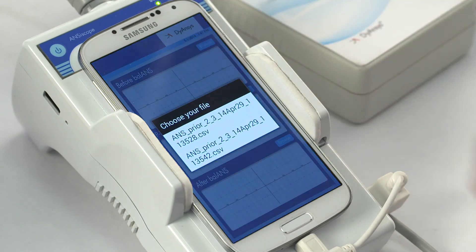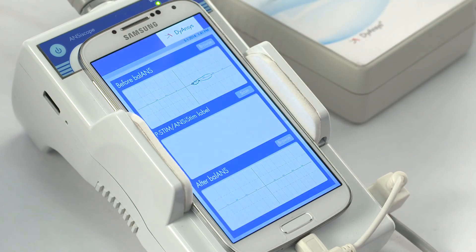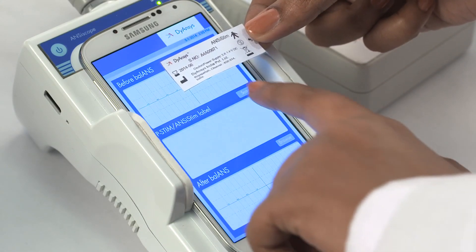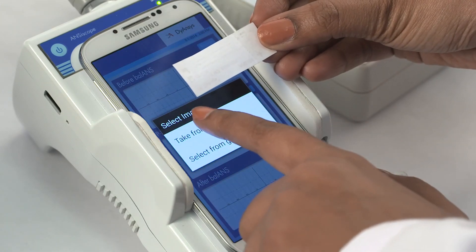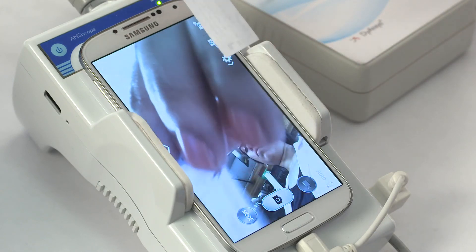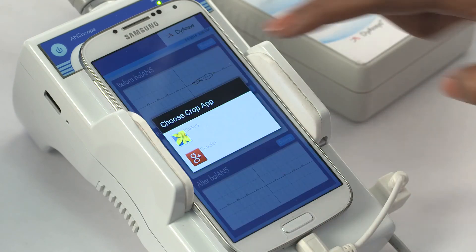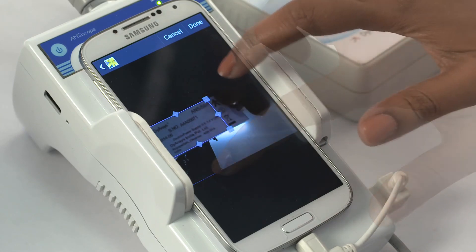View the balance trajectory before treatment. Recording the ANSYSTEM label into the patient record. In the second box, select Scan. Choose the Take from camera option to initiate the camera. Select the front camera to capture the ANSYSTEM label and press Save. Crop the label image using Gallery and press Done to save the label image.